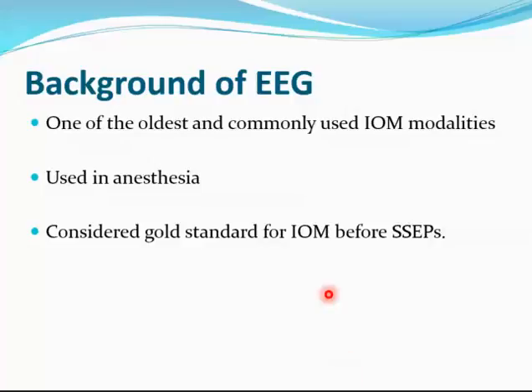All right, now EEG is basically one of the oldest and commonly used IOM modalities. It is even used in anesthesia to measure the depth of anesthesia when the patient is asleep. It was considered the gold standard for IOM before SSEPs were.